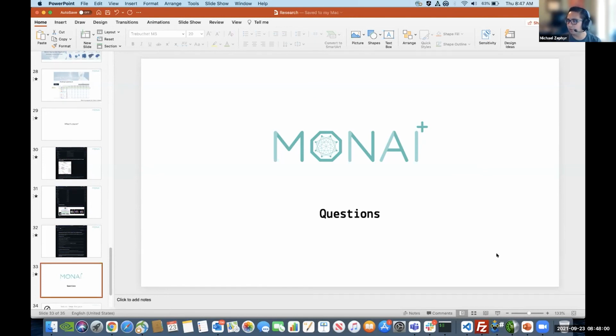So the last question here is, someone asked, have you looked into how large the impact on training time is with only changing the window? For example, was changing the windowing itself super impactful outside of other experimental designs, since a lot of other non-soft tissue input data was suppressed? They're just trying to generally understand whether the HU and intensity are impacting, because they said from Nifty, and how it is impactful on that process.